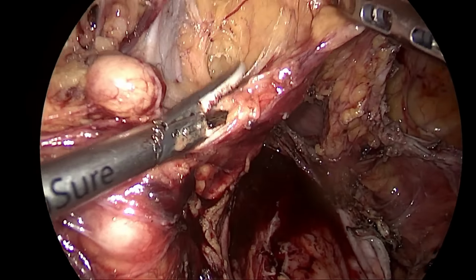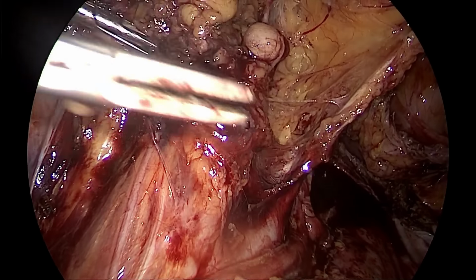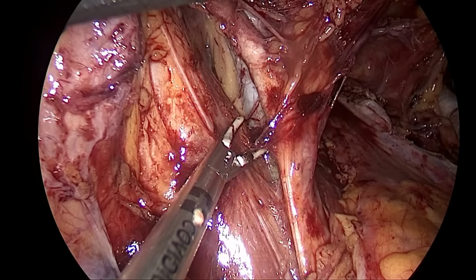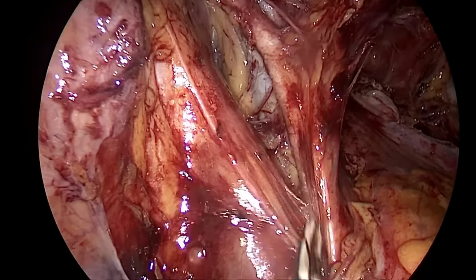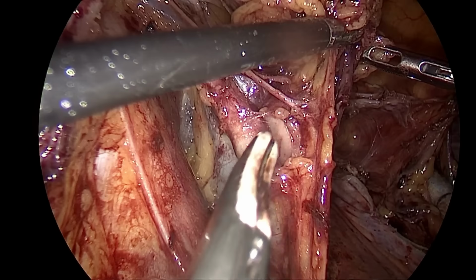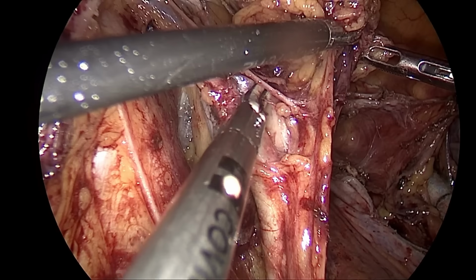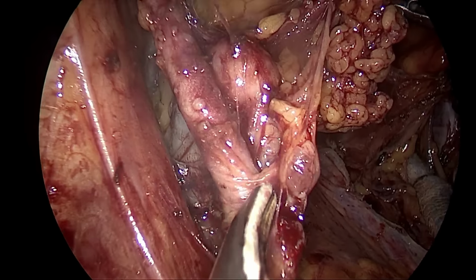So that's the separation from the obliterated umbilical from the medial end. So now we are approaching towards the stuck node. It is mostly stuck on the vein, it seems so.